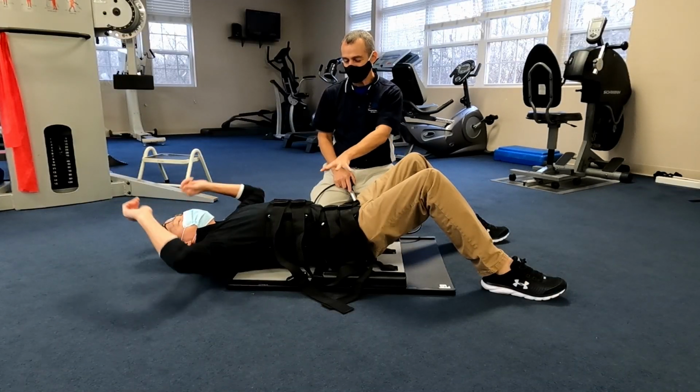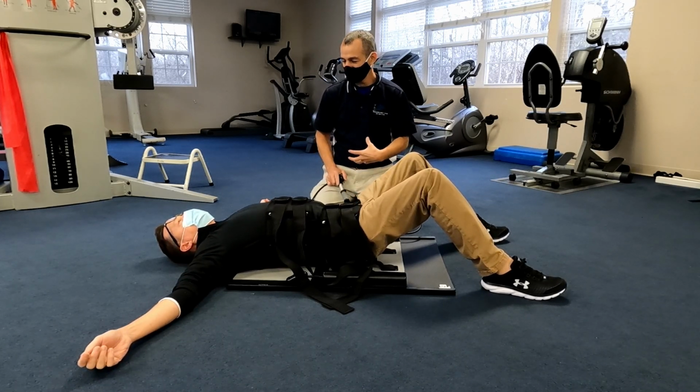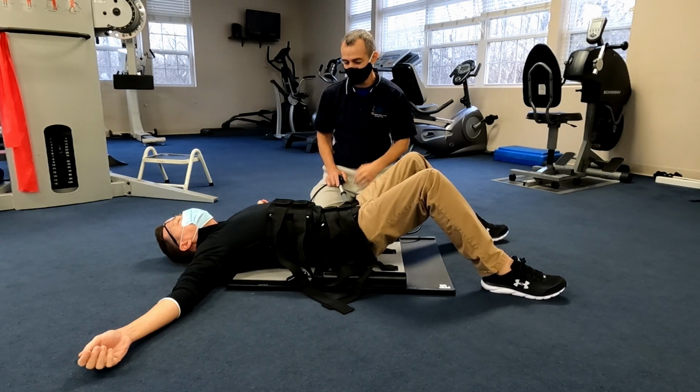And so again, while we have the traction on, we're creating some awareness in the abdomen. Certainly you could squeeze the pelvic floor muscles together. There's other components you can add to this. Let's do one more breath.